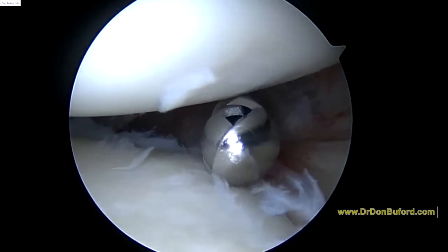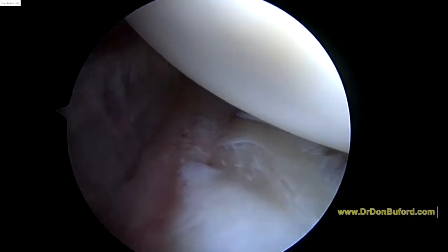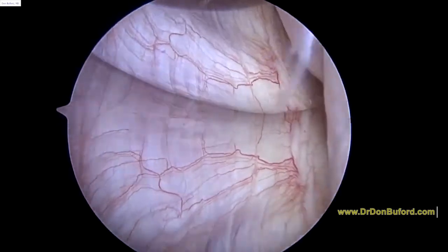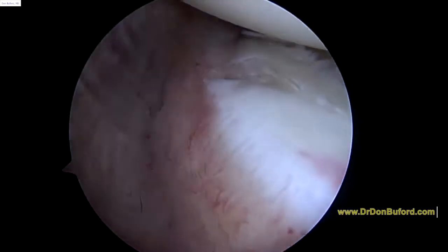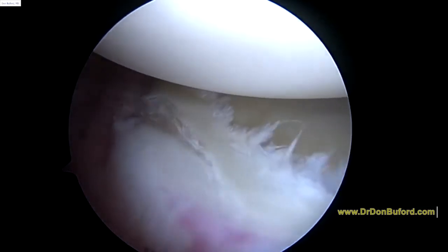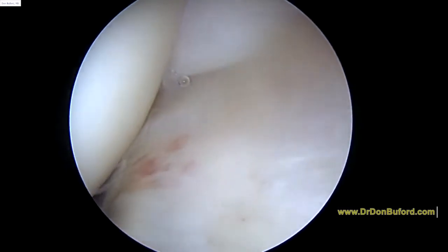We're going to look towards the back of the joint. Here's the posterior capsule. Your joint was not significantly unstable, but I can see some labral tearing back here — see that? So we're going to deal with that in a minute. Your rotator cuff up here looks perfect, nice and smooth and light, no signs of any problems.